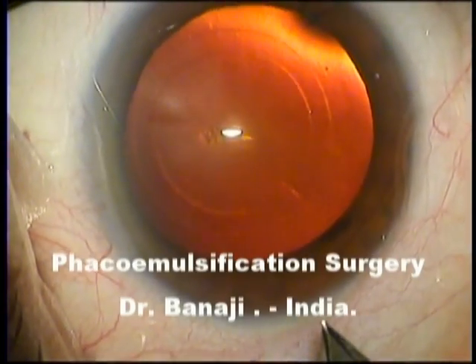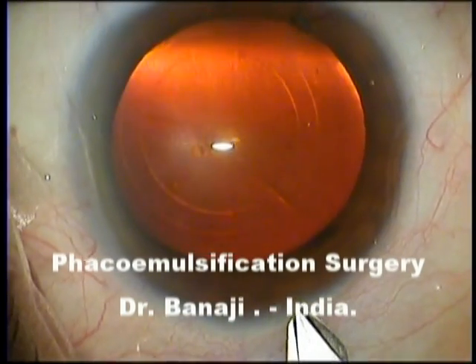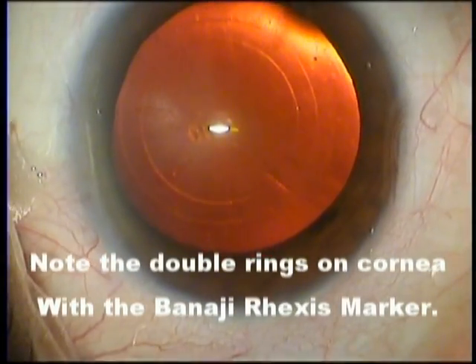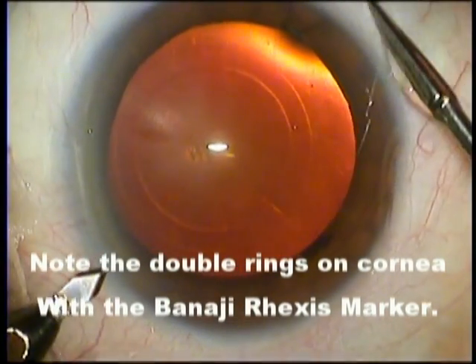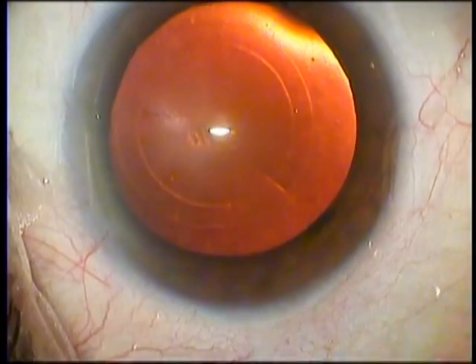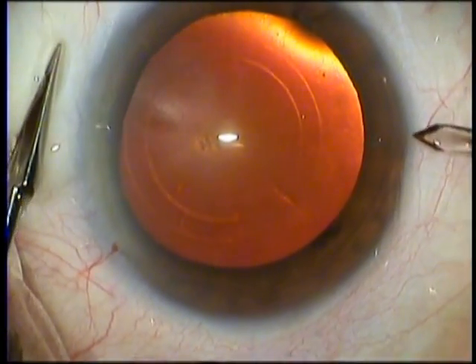In this case, we will demonstrate a phaco from beginning to end. It's largely unedited. Here you can see the double ring on the cornea, which has been made with the Banaji double ring rhexis marker, centered on the visual axis, as you can see here from the light reflects in the center of these two rings, not on the center of the pupil.